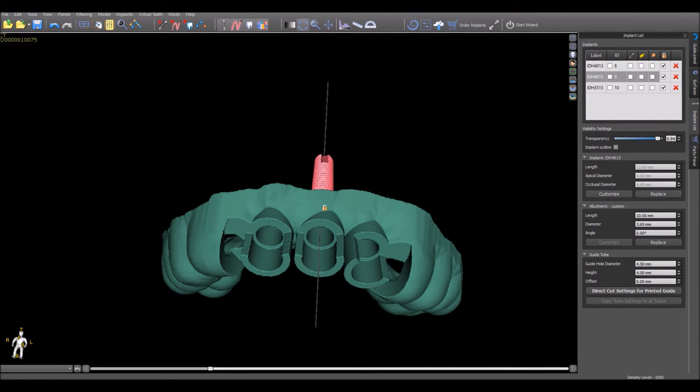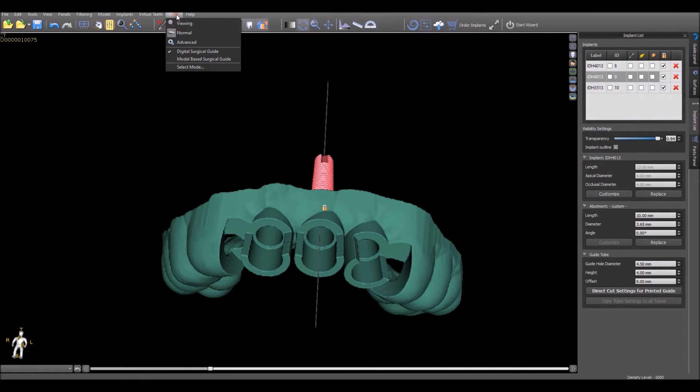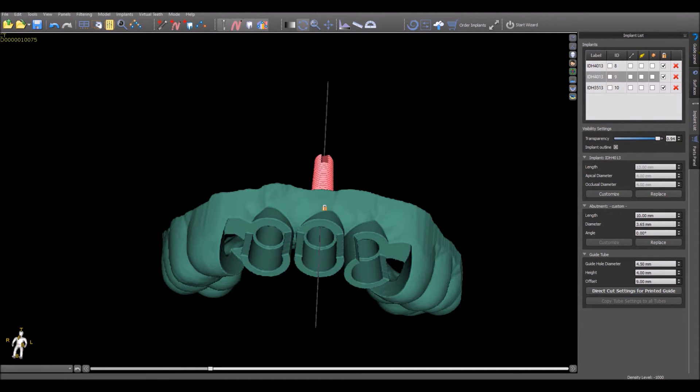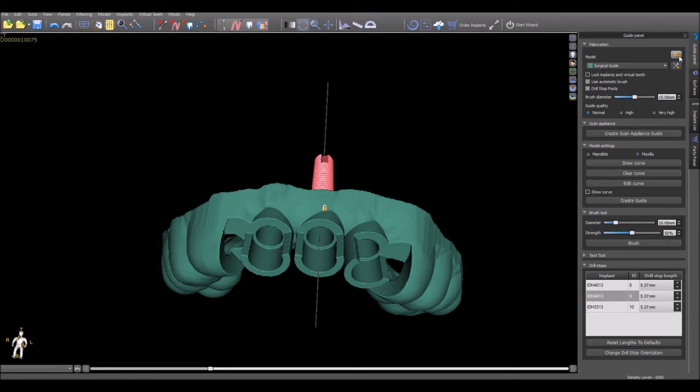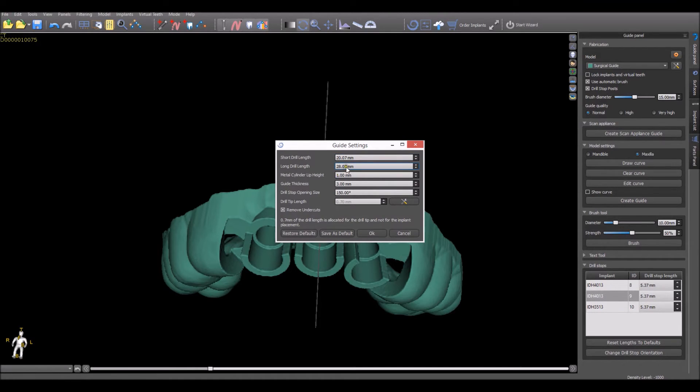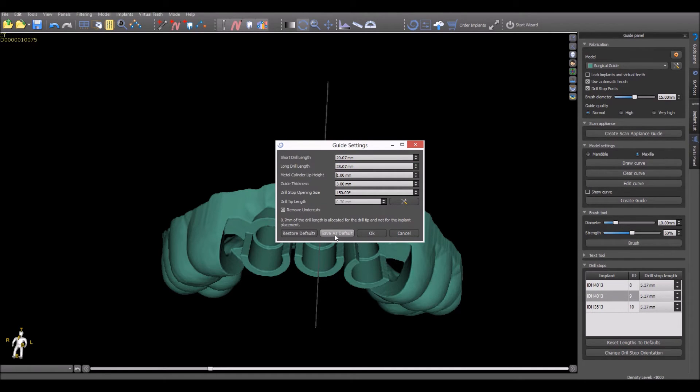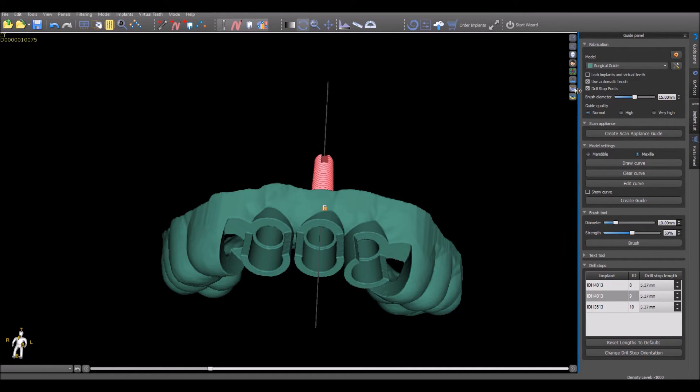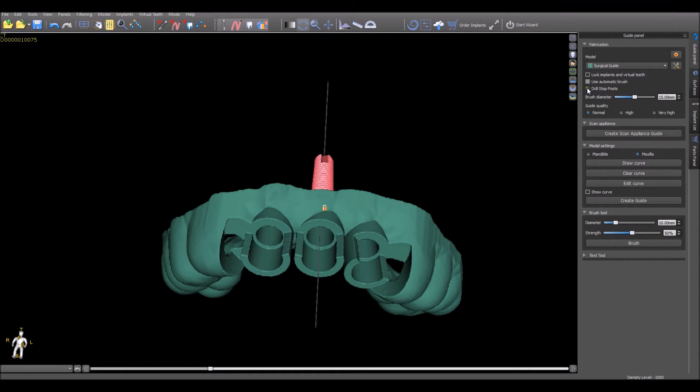Additional advanced drill stop functionality can be accessed by switching the mode to Advanced and going to the Guide panel. By clicking on the gear settings icon, you can see the lengths of the drills protruding from the handpiece for the case, make any adjustments necessary, and save them as default if you'd like these settings to be the global defaults for future cases. If we don't want to use the drill stops for the case at all, we can uncheck the box for the drill stop posts.